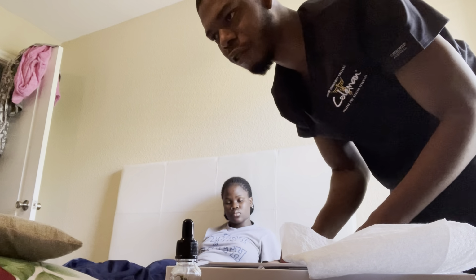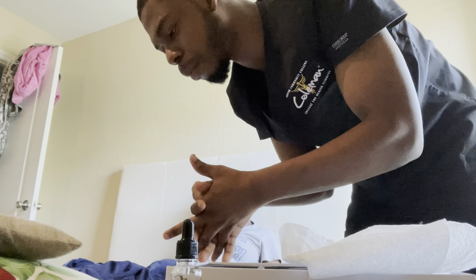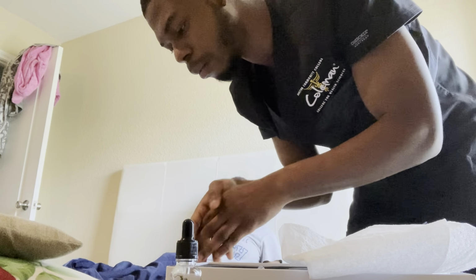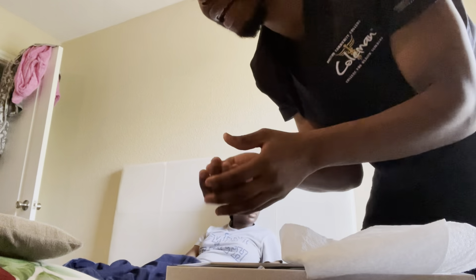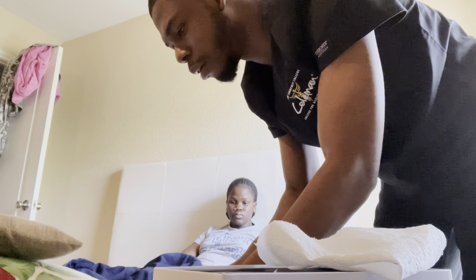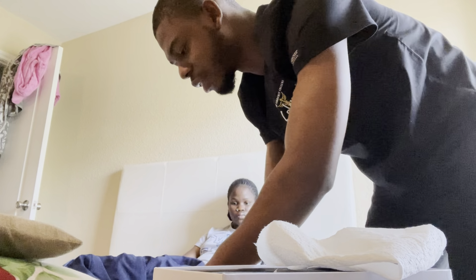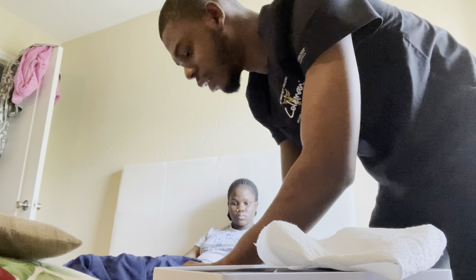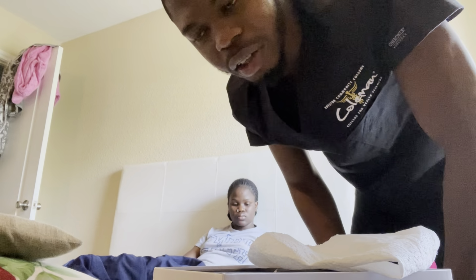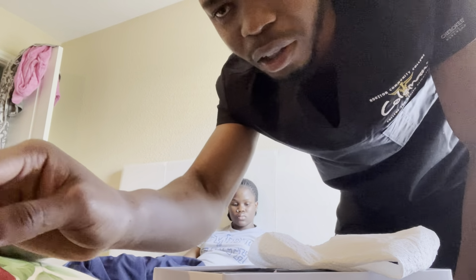When I'm done performing the oral hygiene for the patient, I will perform hand hygiene by using my hand sanitizer or by washing my hands. And when I'm done, I will document the procedure by including how well the patient tolerated the procedure, the amount of secretion, and also the odor of the secretion. And that will complete my assessment on oropharyngeal suction. Thank you.